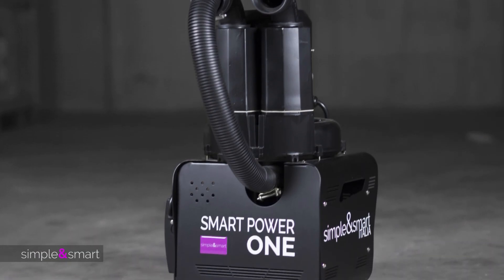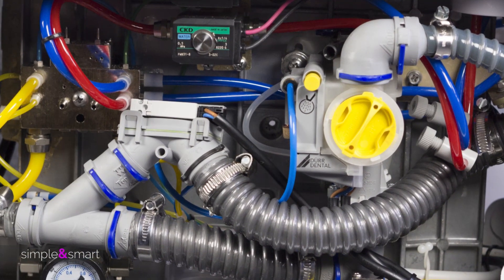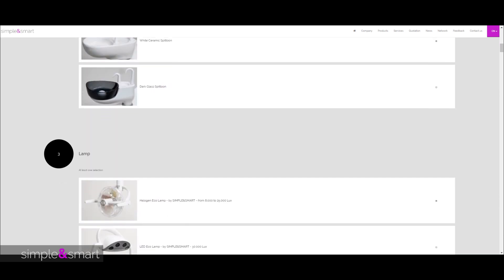Different valves can adapt our unit to any suction system present on the market. Most choices are from the Dürr company. Customize your unit with any improvement you need to satisfy your ergonomic way of working.